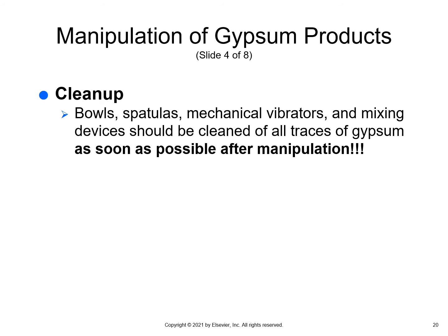If this is allowed to stay in bowls or on spatulas or on the vibrators, it is very, very difficult to remove. So we cover the vibrators in our lab with plastic headrest covers to protect those and keep those looking nice. Spatulas and bowls need to be rinsed out as soon as you're done mixing. So as soon as that's all done and loaded and you've dumped the excess in the waste can, then you'll want to clean that up right away.